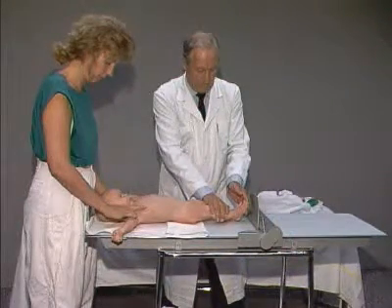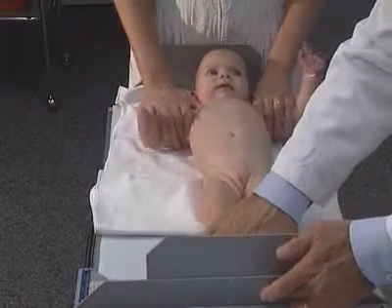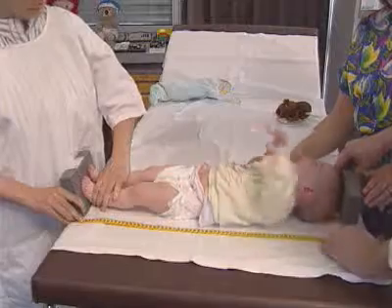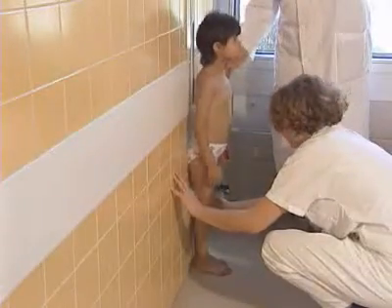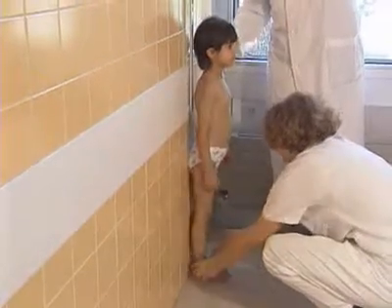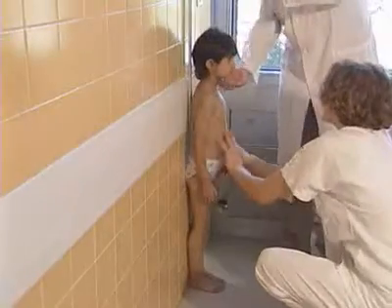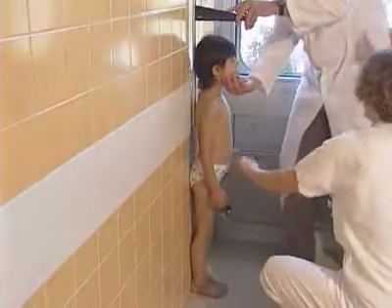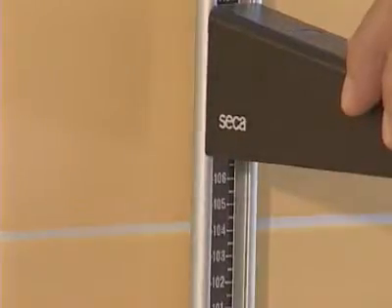The length of a baby or toddler is determined supine with a special measuring tool. In an emergency, 2 books will do. Older children are measured in a standing position. The child should be standing upright with its heels, seat, shoulders, and occiput against the wall. The child's height is then determined using a sliding marker.